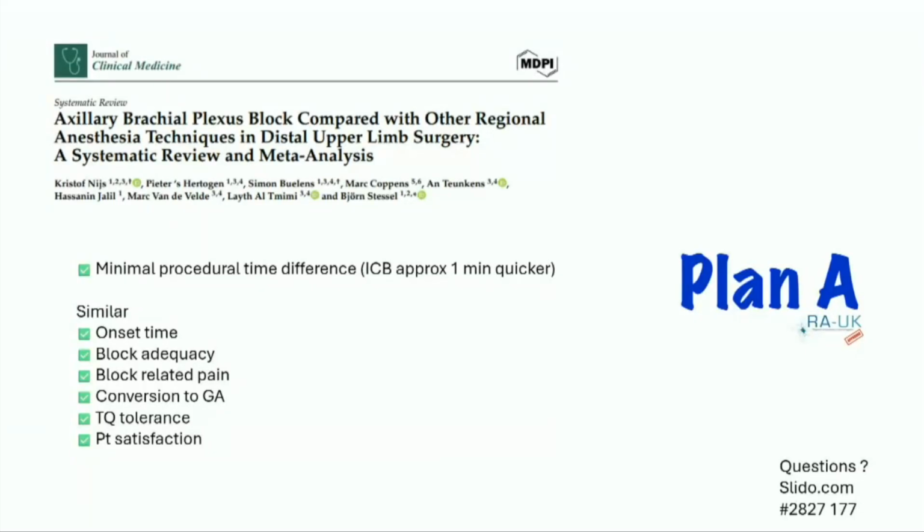And also this is a plan A block. So this is a block which everyone coming through the training system should hopefully be equipped to do. And by doing the same thing many times, you become hopefully good at it, and you recognize the sonoanatomy. Obviously, for teaching purposes, it's quite good as well.